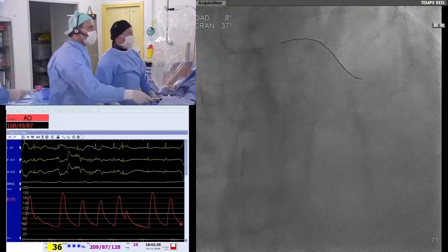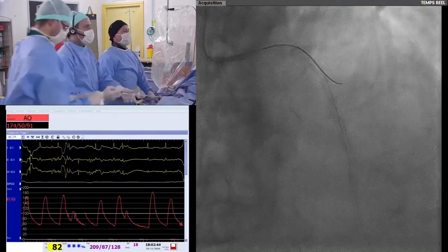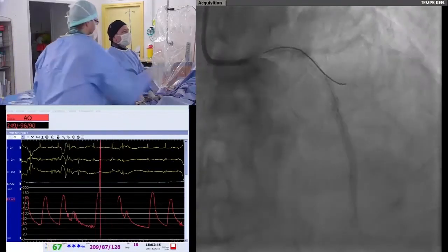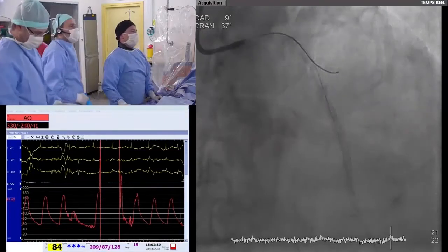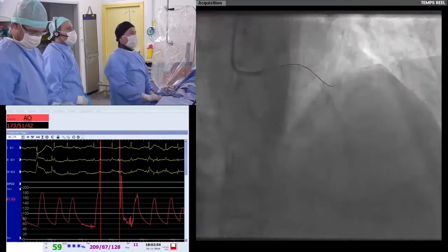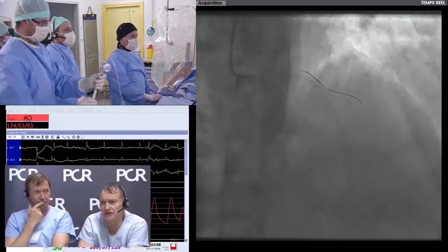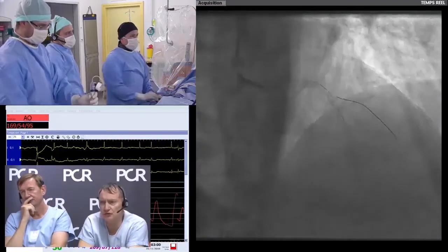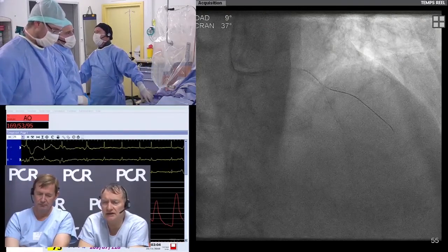We can record this if you want to assess the length. Yeah, cool. So I think we have to use a 48 length. From where to where do you want to stent, Nicola? And do you use a nitrate to know exactly the diameter or not? Do you know with IVUS only, and it's not important to add a nitrate?